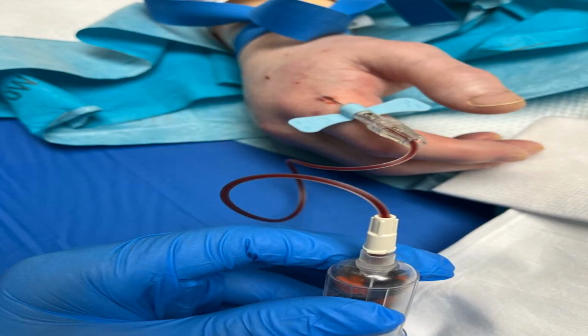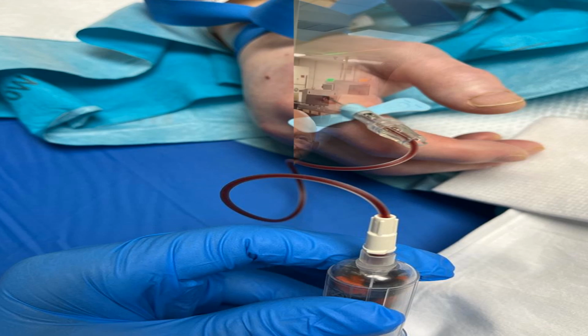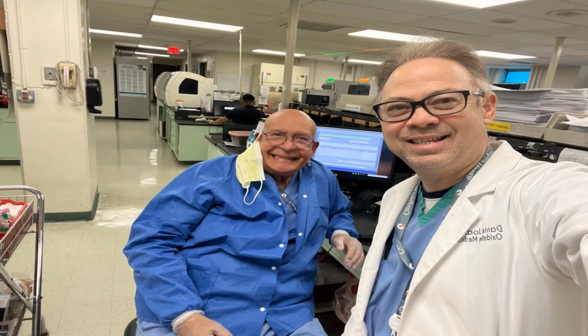So once again, if you don't follow the guidelines found in GP41, si usted no sigue las reglas en el documento GP41, okay, what we are getting for this patient, once again, is what? Is the wrong test result. Now, there are protocols in how we must release the tourniquet just before or just as soon as we get blood tests. You cannot leave the tourniquet longer than 1 minute because that's going to create what is called hemoconcentration.